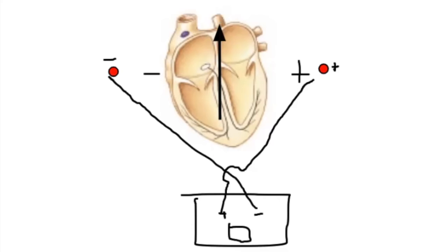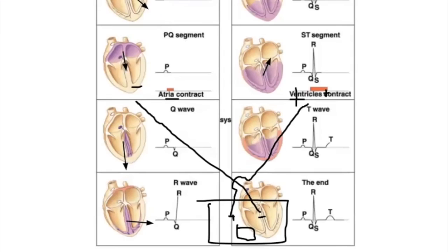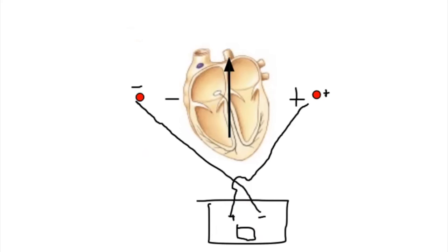How many electrodes do we need to characterize all these possible vectors that we showed here? 2 dimensions or 3 dimensions? Good clarifying question. Let's just stick to 2 for now. Another set of 2, so 4 total. So 4 total. Okay. Could we get away with any less than that?